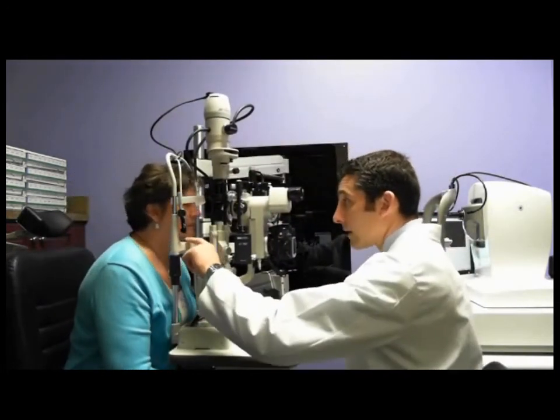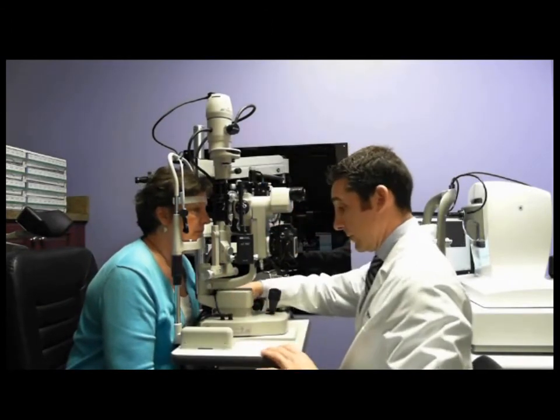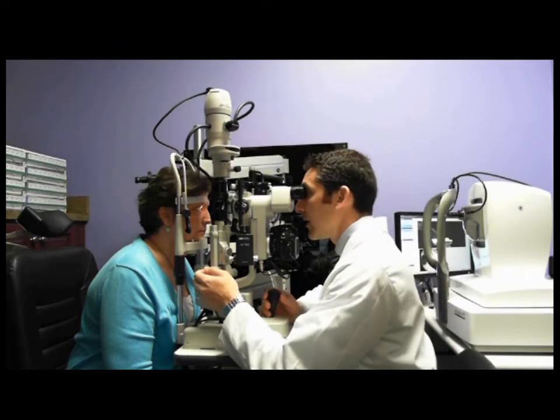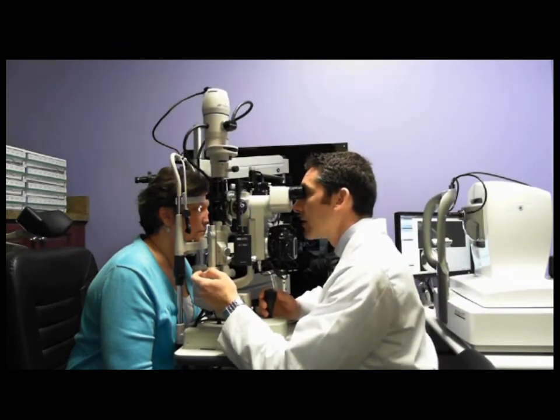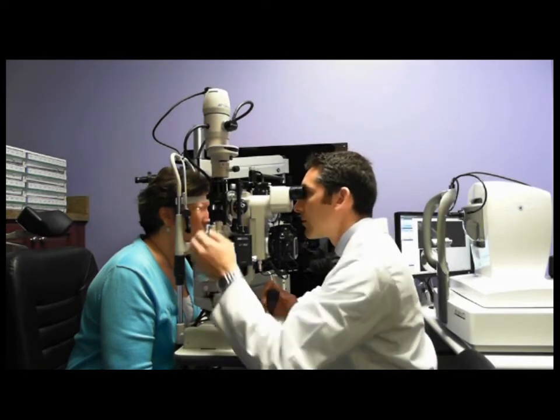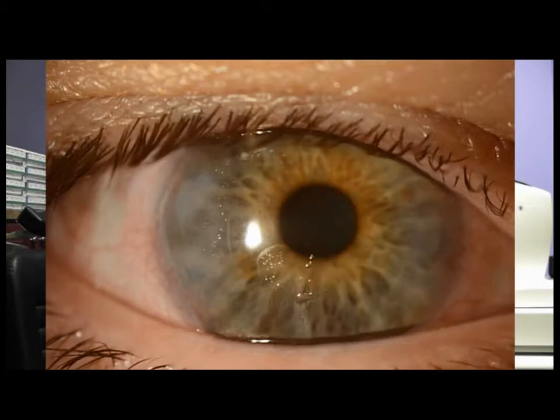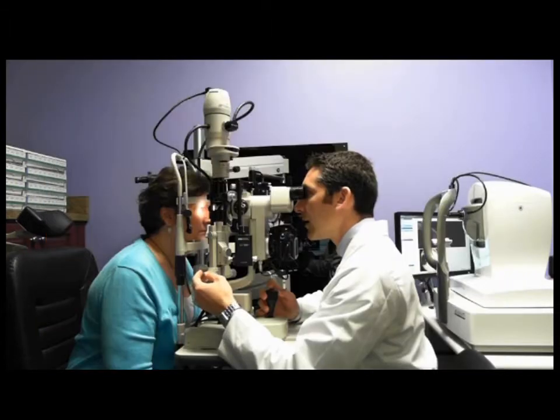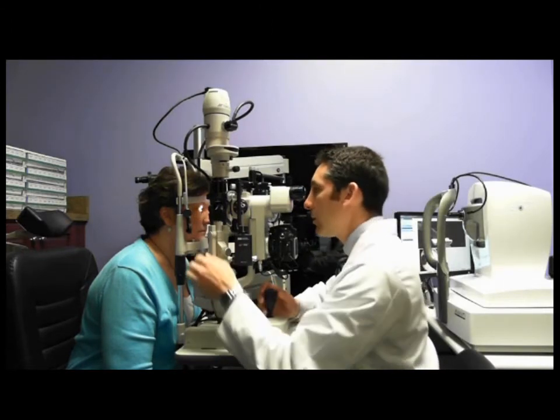So we pull our slit lamp in front and come on forward there. Good. And since you're not sitting in my office looking at the slit beam, what we will be doing though is taking some pictures, and we'll flash that up on the screen. And so the very first thing that I notice, and let's see if we can show this. You'll hear the flash of my camera. The very first thing I notice is that the lens is not wetting incredibly well. We see areas of dry spots, and that's really just because this is a trial lens. When the lens comes from the manufacturer, those issues are resolved.